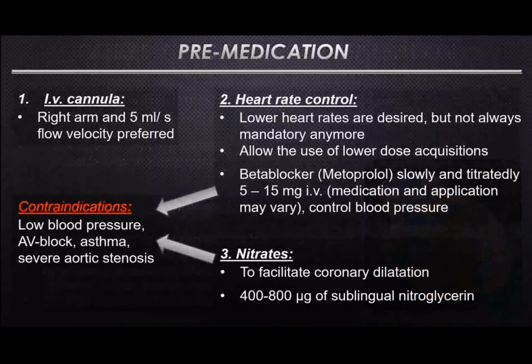It's important in cardiac CT scanning to establish a relaxed and calm environment for the patient. So in the best case scenario, you would establish a separate preparation room where we can talk with the patient, put the cannula in, and just establish a relaxed environment, because cardiac CT is performed with lower heart rates, and when the patient is relaxed, of course the heart rate will also be lower inherently.